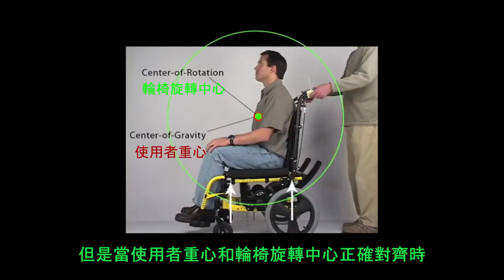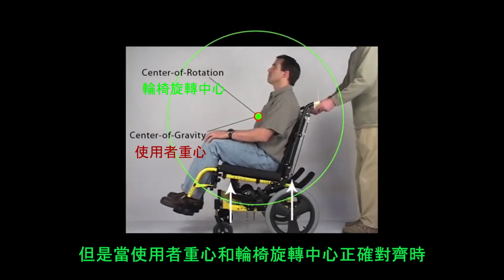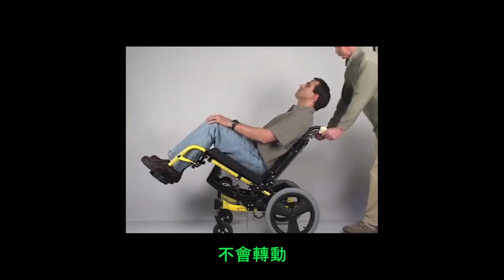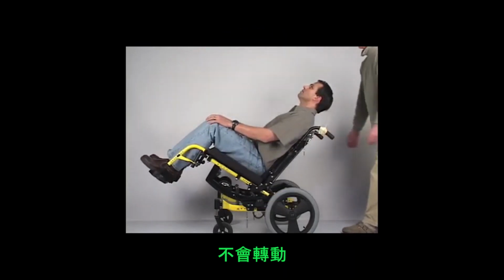But when the center of rotation and the center of gravity are properly aligned, the system can be left in any position with the pins disengaged and will be stable and not subject to rotation.